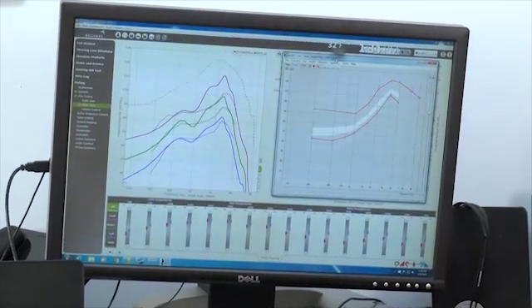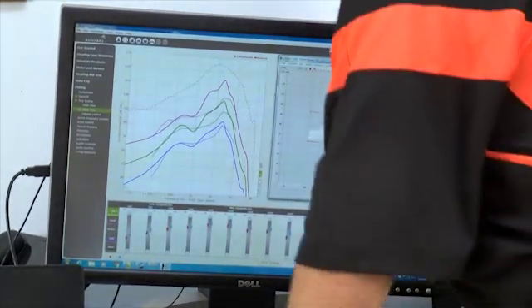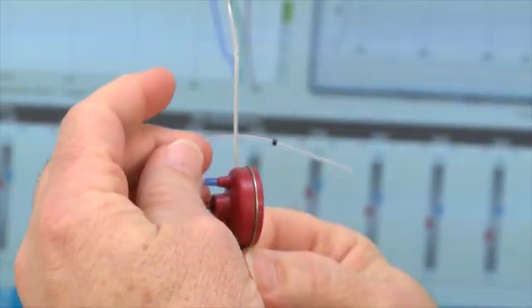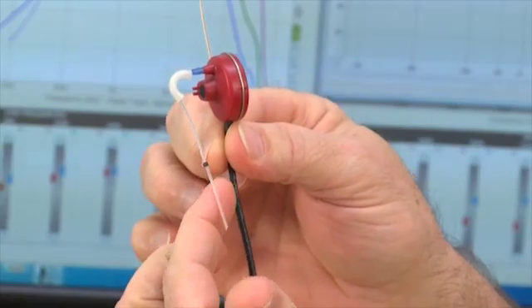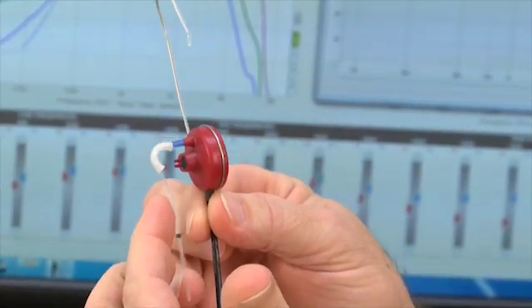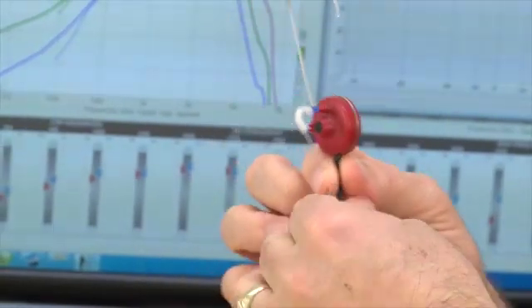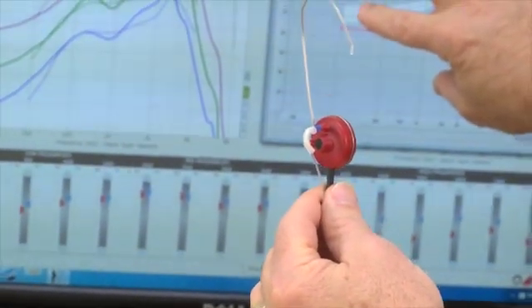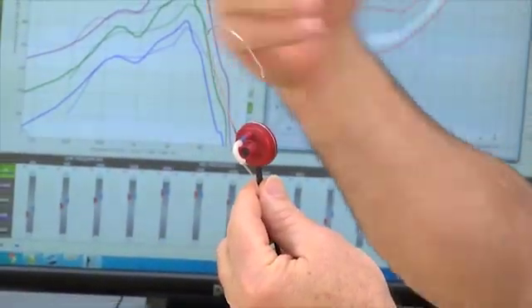And then what we're going to do, Tim, is we're going to put a probe mic in your ear. Well, what's a probe mic? This is a probe mic. And the probe mic is like a little plastic tube. And when this is hanging on your ear, this tube is going to go down in your ear canal. And as it's in your ear canal, that microphone, that tube there, is going to pick up all the sounds that are in your ear canal and it's going to send it back on this screen for me to measure.